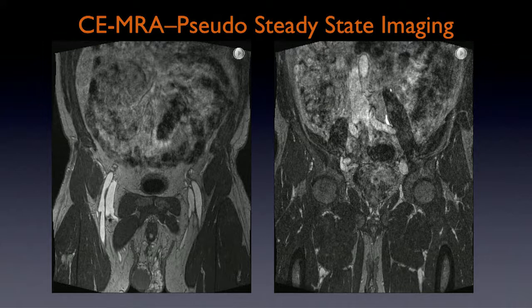But in general, when you're looking in the abdomen, the abdominal aorta is large enough and far enough off the IVC that you don't really need to subtract them to separate out the vessels. You can see both quite nicely.